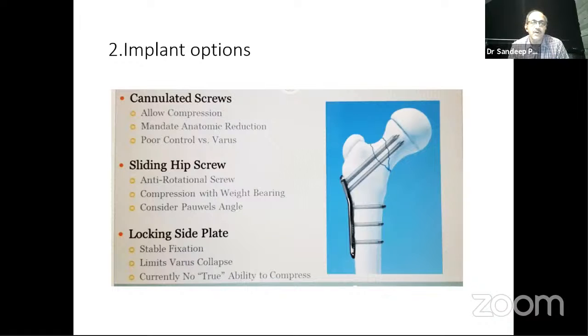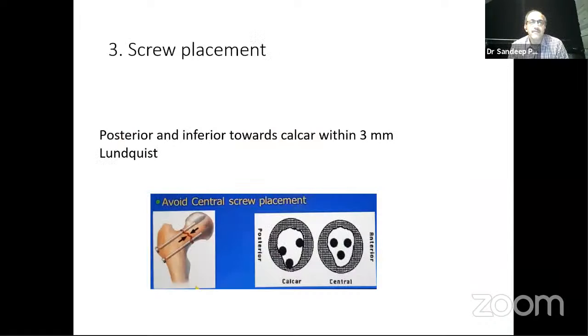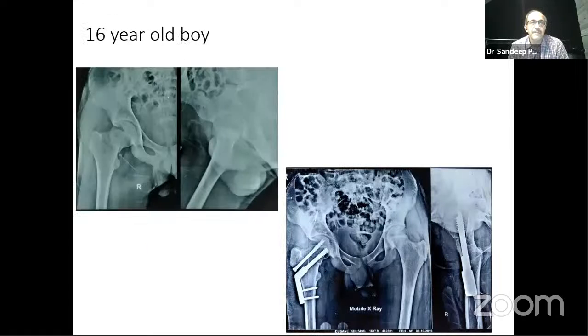A sliding hip screw in an older child is a very good implant to be used, and a locking side plate adds stability, limits varus collapse, but really it does not give compression across the fracture site because the locking screws don't offer compression. When you're placing your screws, Lundquist has published that you place them inferiorly and posteriorly towards the calcar. And as Dr. Ken showed, they have to be spaced out rather than close to each other, acting like one screw. An example, in a 16-year-old boy, a dynamic hip screw is the treatment of choice.